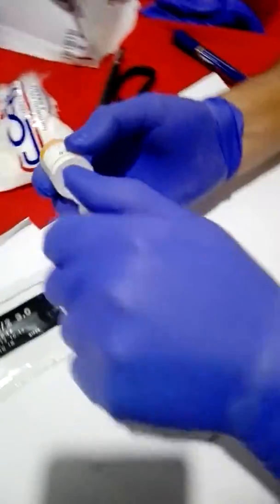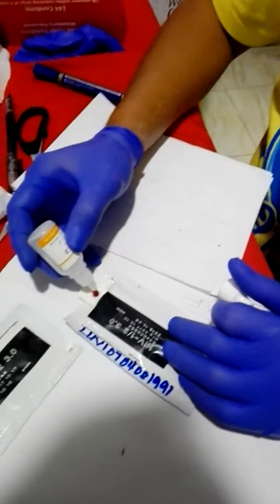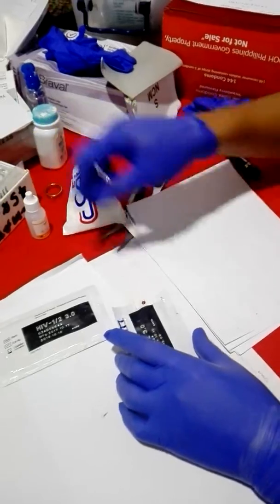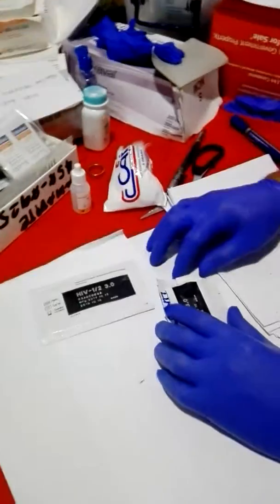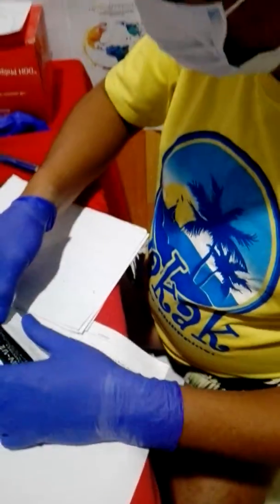After that, we need to use the diluent, in order to keep the blood from hemolyzing, in order not to make the blood clot. It's like a heparin. After that, our screening motivator needs to note the exact time. It will take 20 minutes for the result.